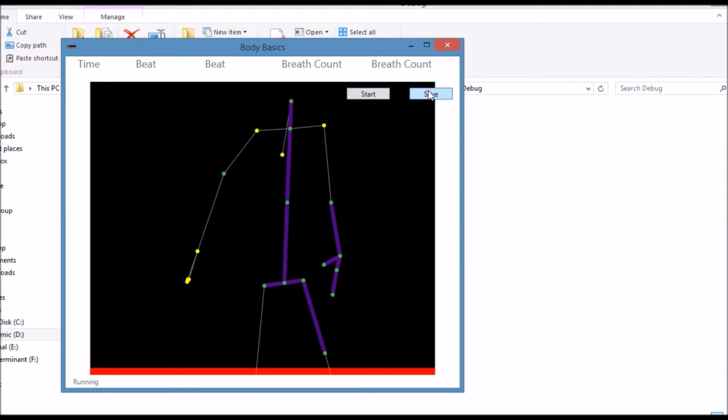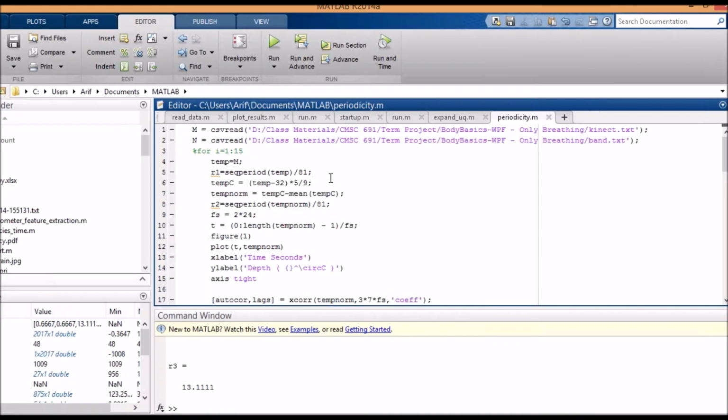Our WPF app captures the accelerometer data from Microsoft Band and chest location depth information through Kinect. When we press the save button, both of the sensor data are saved into different files. Here we can see that Kinect.txt is containing all of the depth information of the Kinect sensor of the skeleton joint. That means the chest depth information in meters. And in the band.txt we saved the magnitude of the accelerometer x, y, and z axis.